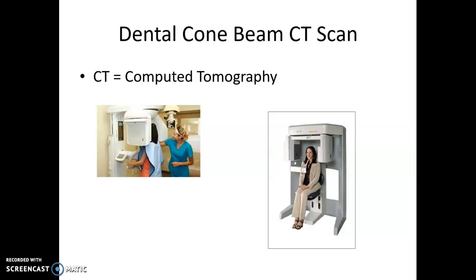But a cone beam just means the cone beam, just like we've been using. The PID used to be referred to as a cone. So cone beam is just your traditional radiation. CT stands for computed tomography, meaning that the information collected during that radiographic exposure is put together differently by the computer. So you get your image, but then the computer is able to use the data collected during that image to recreate a three-dimensional reconstruction of that patient's jaw or whatever was scanned.